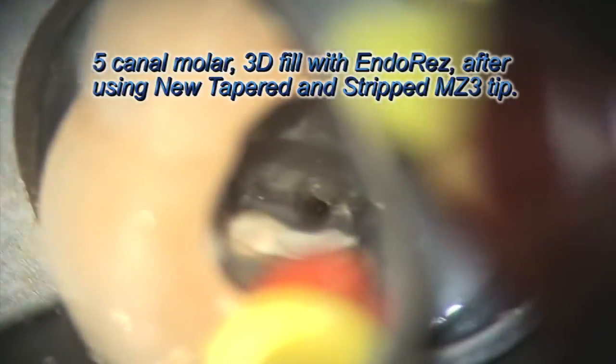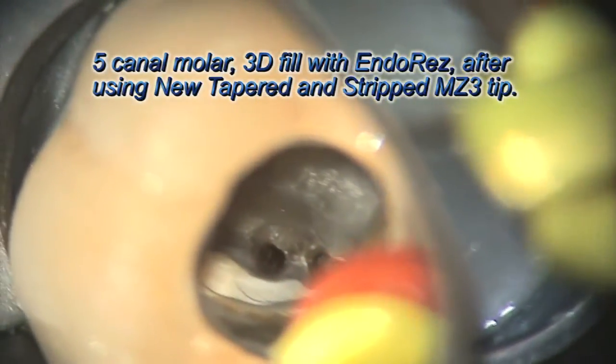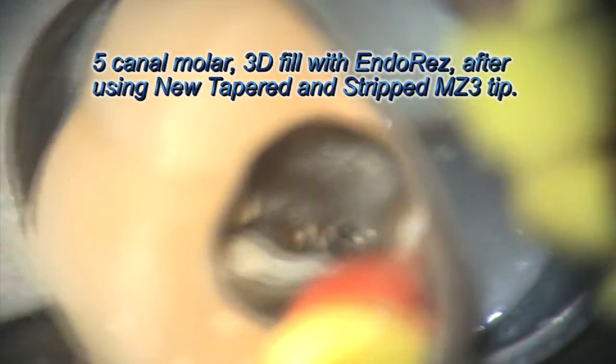Here's a lower canal — a five-canal molar. There are three mesial canals here; this is a lower first molar, not a wisdom tooth. I'm filling one canal and I'm three-dimensionally obturating all the canals at the same time. You can't do that with a conventional gutta-percha approach.